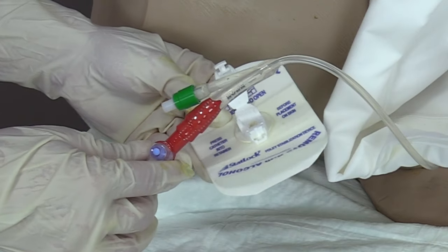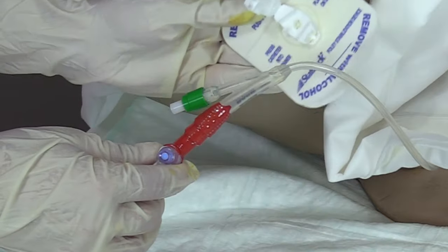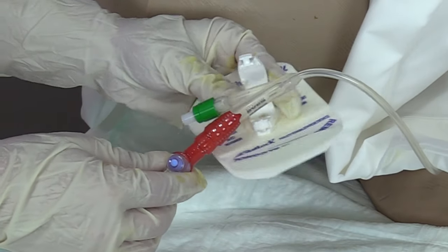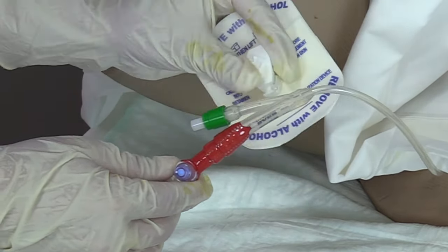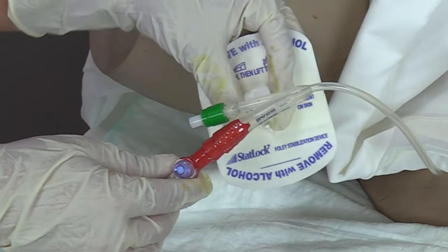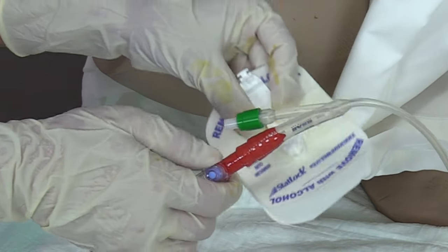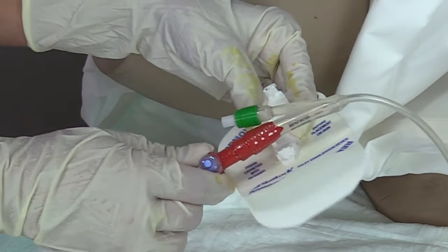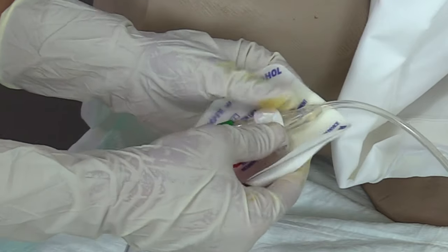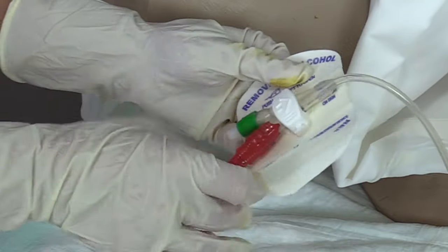The first step before placing this on the patient is to put the catheter into the retainer, because we don't want to put this on the patient's skin and then clamp it shut — it's not going to feel good to the patient. We have the arrow pointing towards the insertion site. We're going to take the bifurcation of the catheter and there's this little part hanging off the white part — it's going to set in between the catheter right here. Then we're going to close it shut by pressing these little lines, not in the middle, and it's nice and in place.